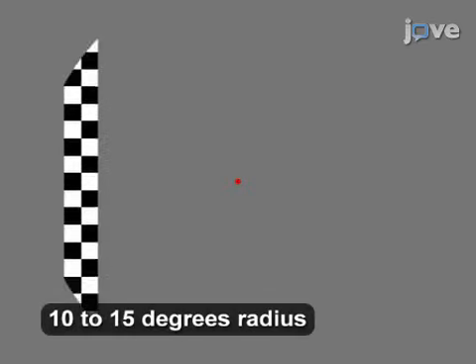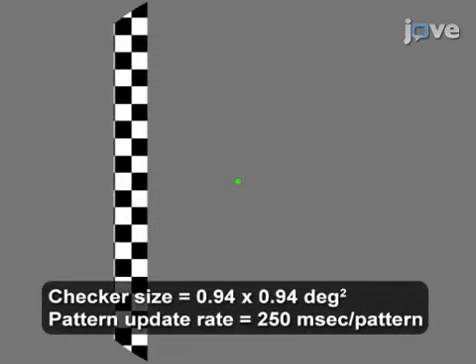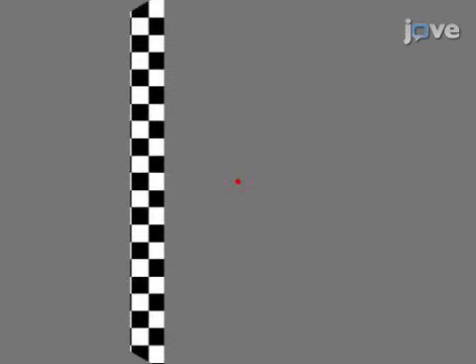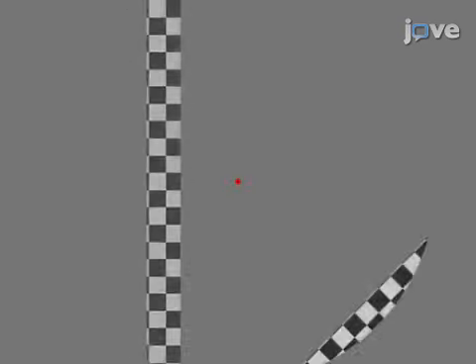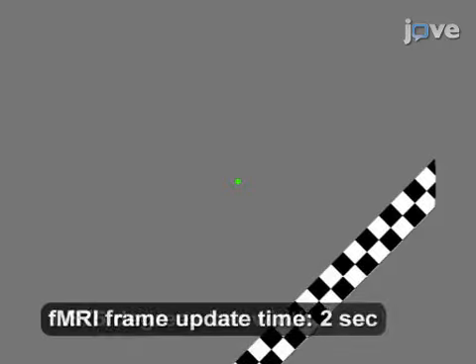To define a field of view in visual angle over which the stimulus is presented, present the moving or flickering checkerboard patterns within the bar to elicit strong visual responses. Then, input the specific parameters such that there are 8 evenly spaced directions of motion, and the bars move by half the bar width per frame. Next, scan the brain of a subject in an MRI scanner using a typical echoplanar imaging scanner.